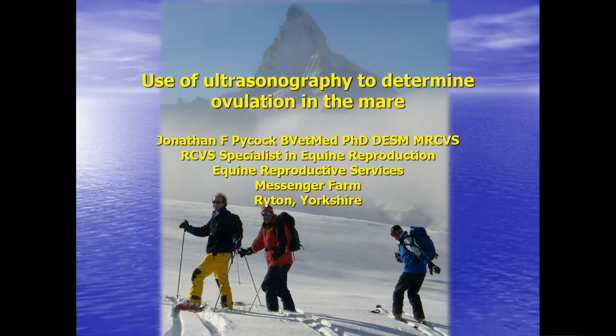Okay, today we're going to talk about the use of ultrasonography to determine ovulation in the mare. This seemed a good topic to start with because it's a very common procedure all of us involved in equine reproduction will do on a daily basis, trying to predict when ovulation occurs.